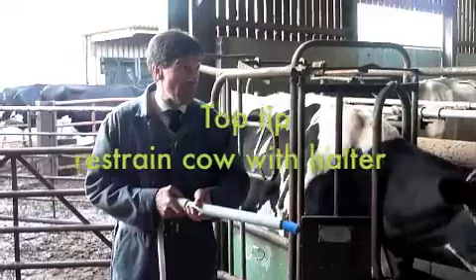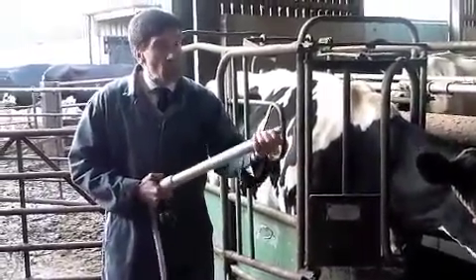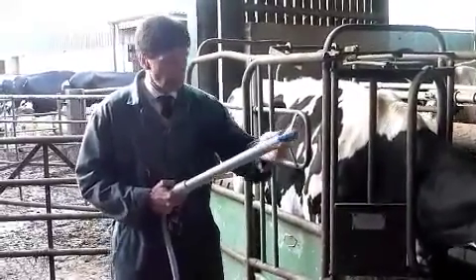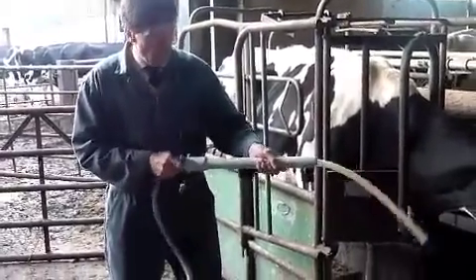So that she can't bite through this flexible hose. We've got a rounded end on the tip which encourages her to swallow it, and we can run the gag through the hose, and then when it's in the right place we can turn that lock to hold it in place.